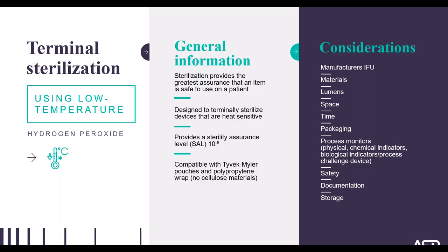Terminal sterilization does have some convenience because you get a packaged product that can go on the shelf or you can use it immediately. It also provides that sterility assurance level of 10 to the minus 6, meaning that there's just a chance in a million a microorganism has survived. However, just like the other two processes, there are some considerations. Is the device validated by the manufacturer to be terminally sterilized? Remember, we had talked about old bronchoscopes, and they may not be materially compatible with terminal sterilization.